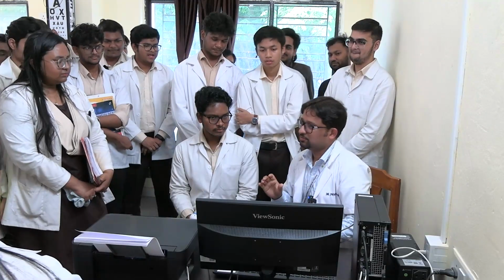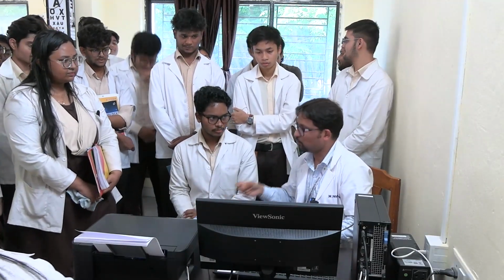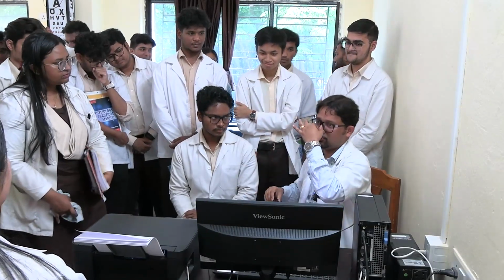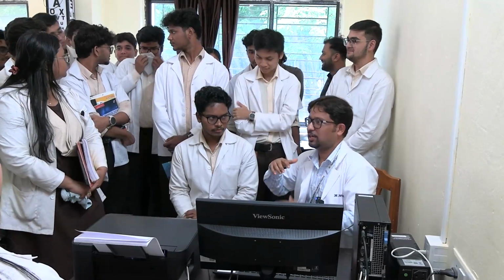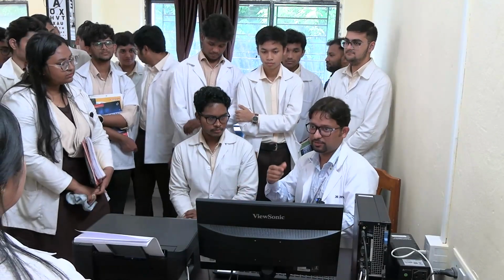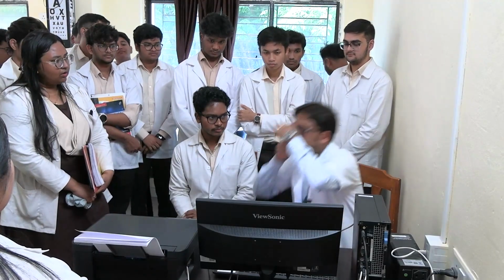So this has to be done. First I have taken inhalation through the nose. I have put the mouthpiece inside my mouth, lips tightly sealed. Nose, you can use this nose clip to clip the nose, or I can use the fingers also. And then, as much as you can and with as much speed as you can, exhale into it without stopping. Again, you have to take a deep inhalation. I'm again showing.